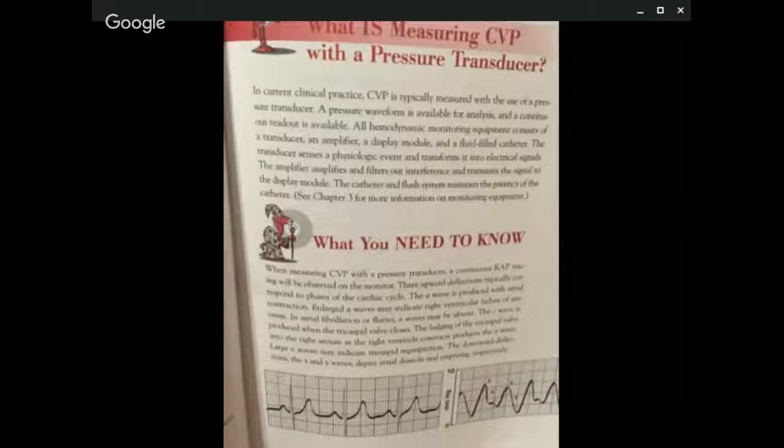The transducer senses a physiologic event and transforms it into electrical signals. The amplifier amplifies the signal, filters out interference, and transmits the signal to the display module. The catheter and flush system maintain the patency of the catheter.